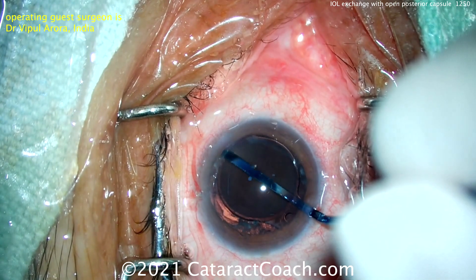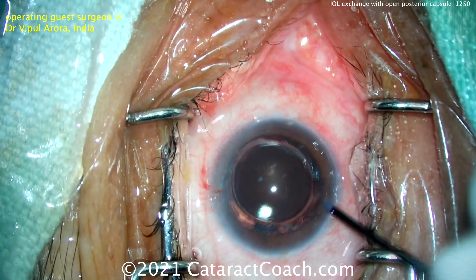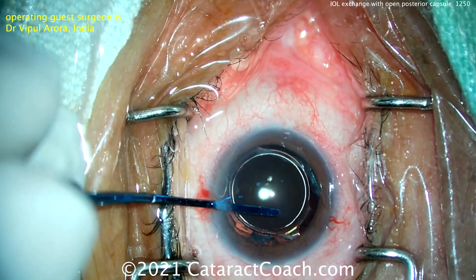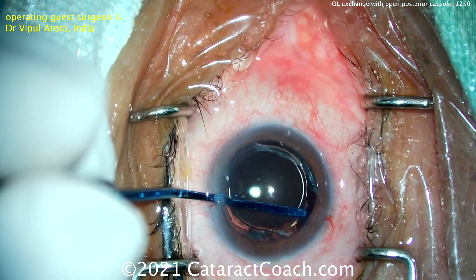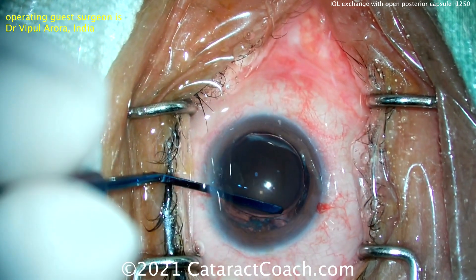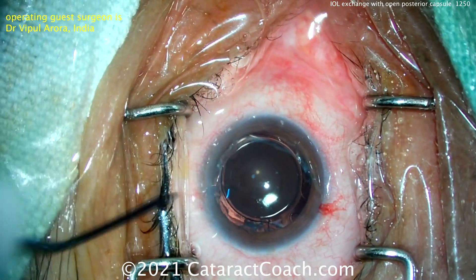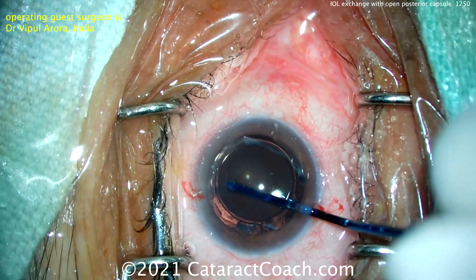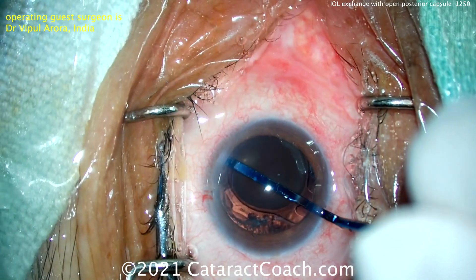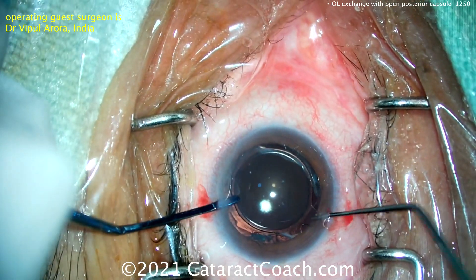Careful, careful opening of the capsular bag here using a blunt spatula. Two paracentesis incisions were made, so you can go from the left and the right. This is why it's important for young surgeons to learn how to use both hands. Nice and easy, opening up the capsular bag. The key is taking your time, getting that capsular bag open, hopefully for 360. That's going to help you dissect that old lens and get it up into the anterior chamber.